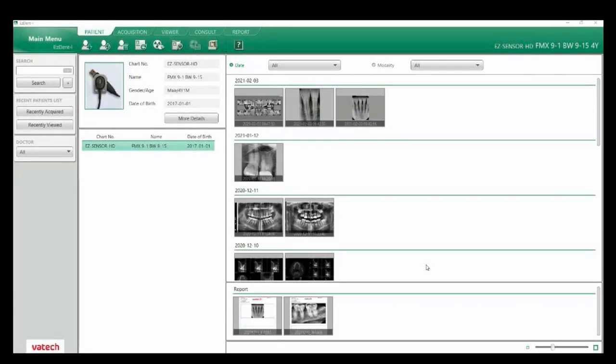We're going to look at the Vatech Easy Dent I software — specifically the workflow, setting this up to capture images all the way through reports. Today you can expect to learn about our main menu settings, setting up auto save, changing our teeth codes, where to add your office information and email. We'll look at the patient tab for adding and searching patients, the acquisition tab to select layouts and capture images, the viewer tab for viewing and saving layouts, and finally an overview of the report tab.